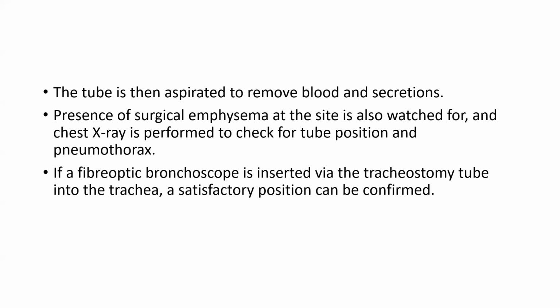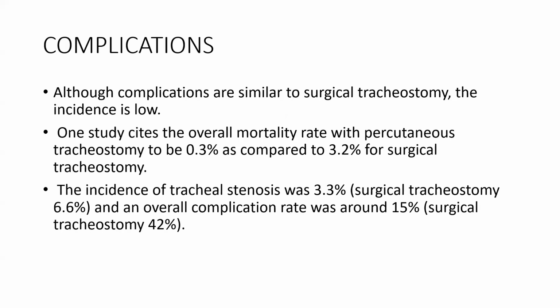The tube is then aspirated to remove blood and secretions. Presence of surgical emphysema at the site is also watched for, and a chest X-ray is performed to check for tube position and pneumothorax. A fiber optic bronchoscope is also inserted through the tracheostomy tube into the trachea. Satisfactory position can be confirmed.